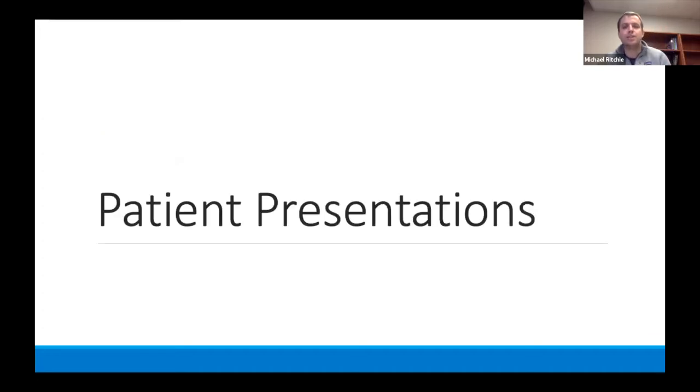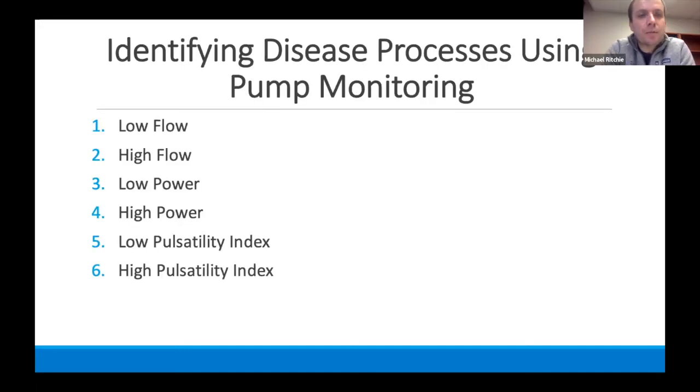So we're going to talk about patient presentations, and hopefully I'll spend some time on this one. I know I've been going over a lot of stuff, but hopefully this will kind of make more sense as we go forward. So whenever you're identifying what's wrong with the patient, your patient presents and you're saying, what's wrong with them? What's going on? What can I do? You can use the pump monitoring to kind of narrow your differential. So we talked about flow, power, and pulsatility index. So the patient can have either low or high flow, low power or high power, and then a low pulsatility index or high pulsatility index.